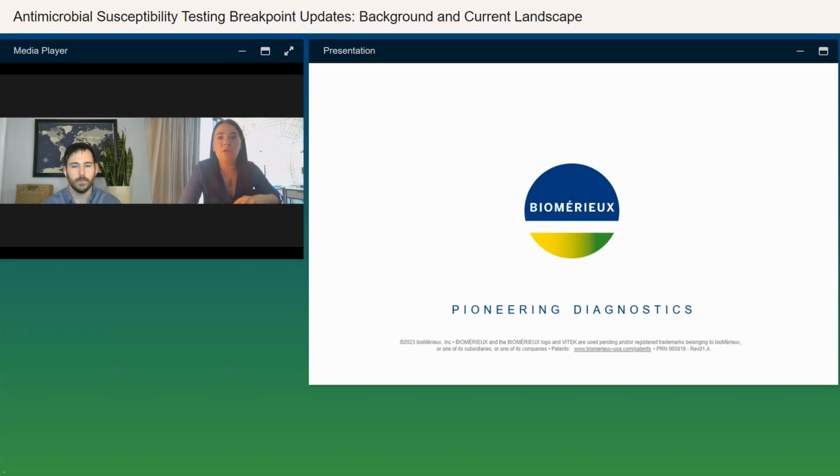And I know it's going to include, I think, things like organism sets available through that CDC AR Bank, sets that maybe are a little more conducive to some of these validations that are needed, educational materials, resources, things like that. I know that CAP's been doing a lot of educational work, both in real-time presentations as well as written works, and then organizations like ASM are doing a lot of science communication and advocacy work around this issue as well.